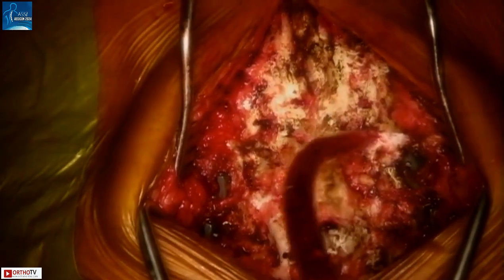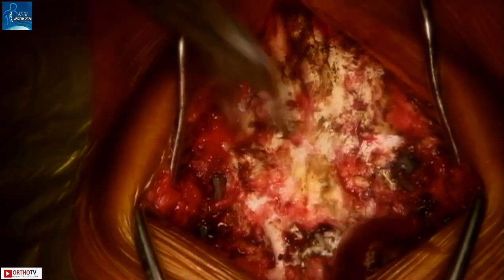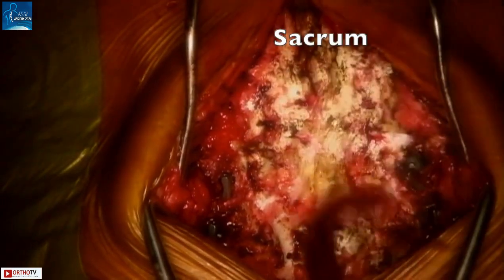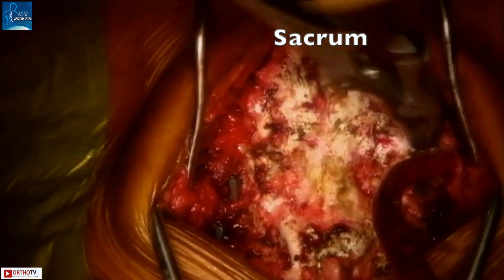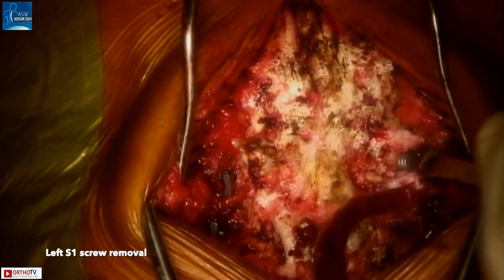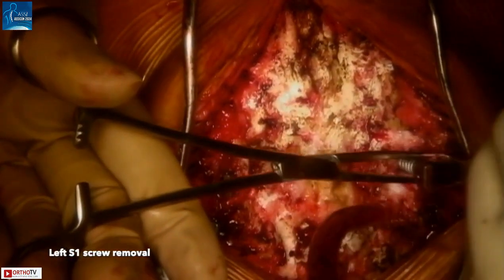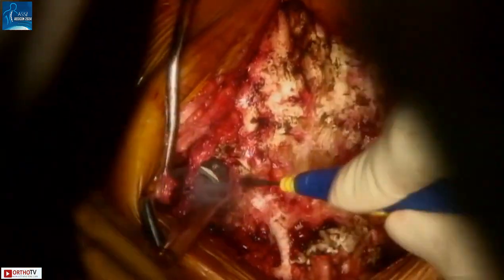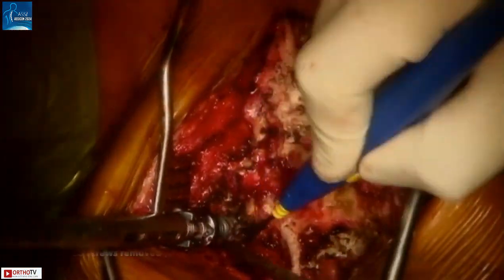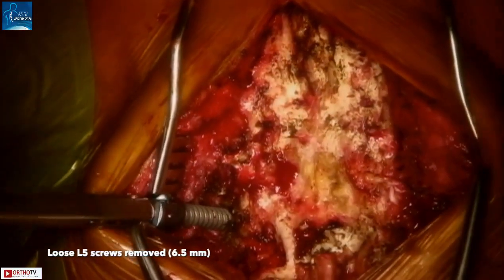A standard subperiosteal exposure was done from L4 down to the sacrum, taking care not to enter the laminectomy membrane. To orient you, the top of the screen shows the sacrum and the bottom shows the L4 lamina. To begin with, all four pre-existing screws were removed. These were found to be extremely loose and came out easily. On testing for mobility, we found a frank nonunion at the L5-S1 junction.